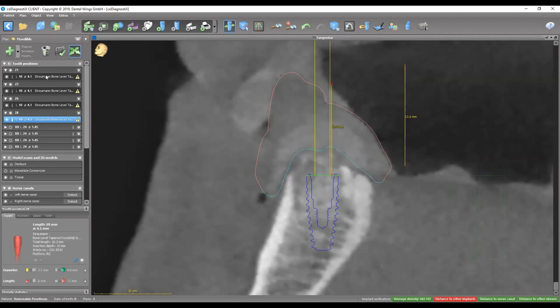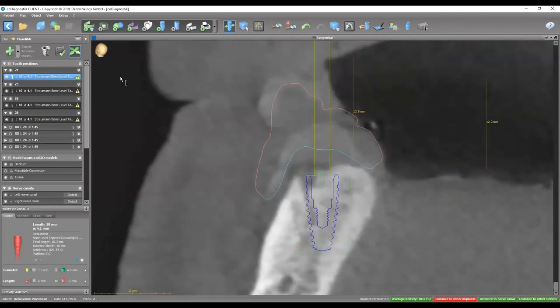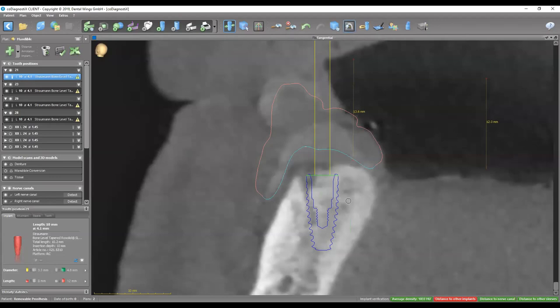Bone support around number 28 looks really good — good distance away from the lingual and buccal plates. Checking the distal implant on the other side, number 21, also a 4.1 by 10. You can see how dense the bone is. There's a tool in the software to measure bone density in Hounsfield units — the units here are almost 800 to 900, which is around D2 bone on the lingual surface, and almost 1,200 Hounsfield units on the buccal side, which is around D1 bone.